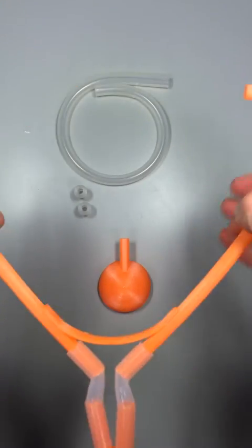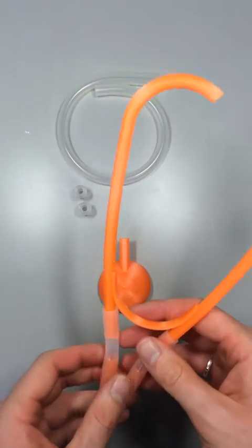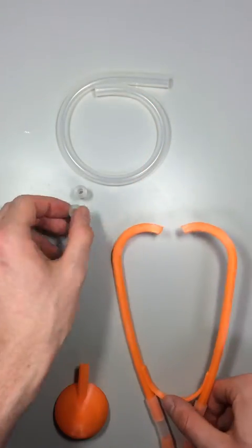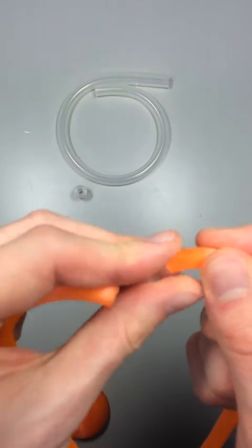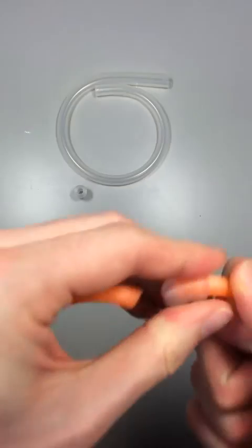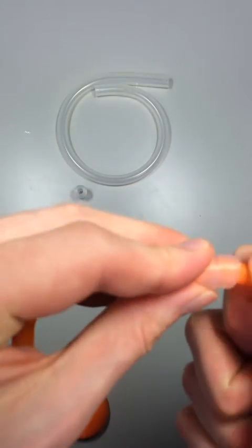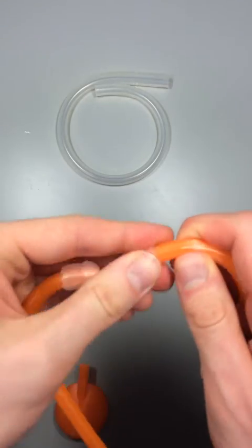These can actually be spread quite wide, don't worry about the join. And then in regards to the earbuds, you can stick them on here. Everything is nice and press fit, so it should just fit nice and snug.